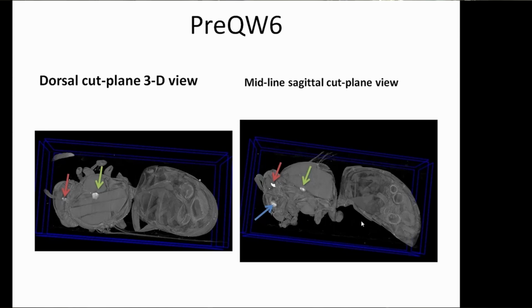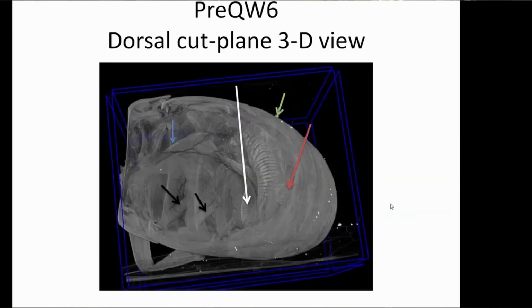I'd like now to turn to the abdomen. So, a dorsal view cutting in. We're seeing that these aren't normal air sacs. This is air due to a perforation. We would not normally see these abdominal protractor and retractor muscles. They're seen very clearly because of air surrounding them. We're also seeing this bowel abnormally well.